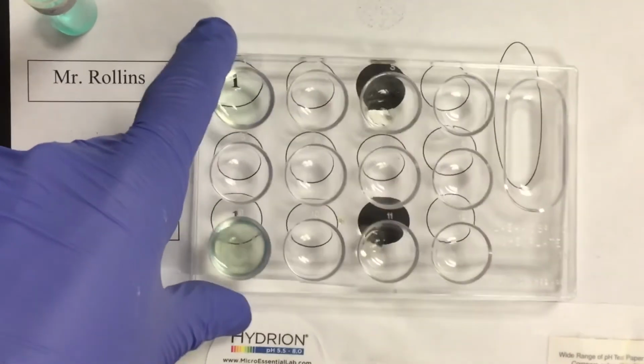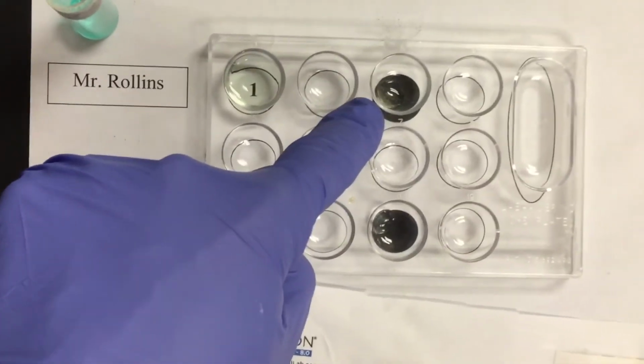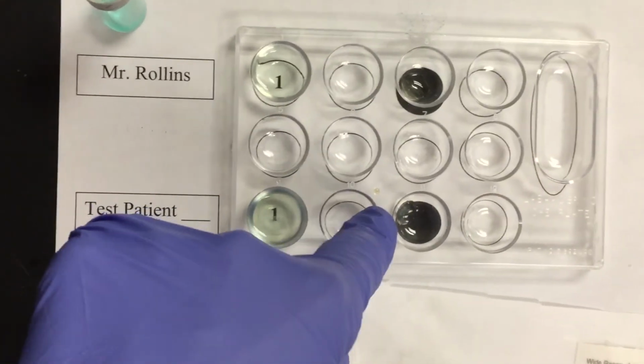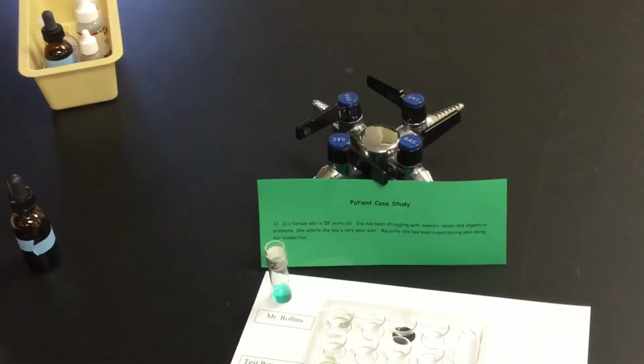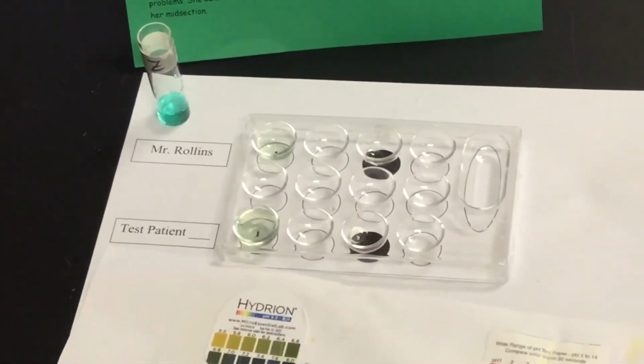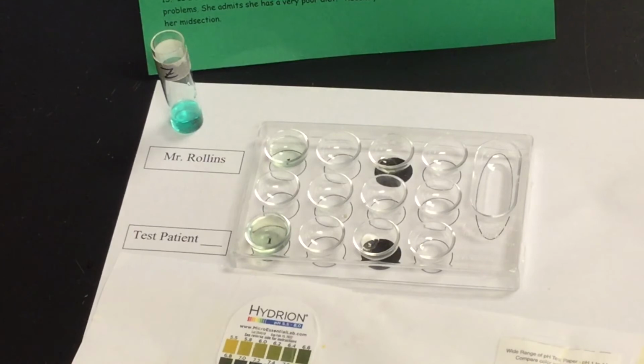In terms of my chloride, I added 1 drop of my chloride solution with 1 drop of urine. They are both negative for chloride as well. So far we have negative protein, we have negative chlorides, we have very high pH, and we have translucent urine that is very light in color.